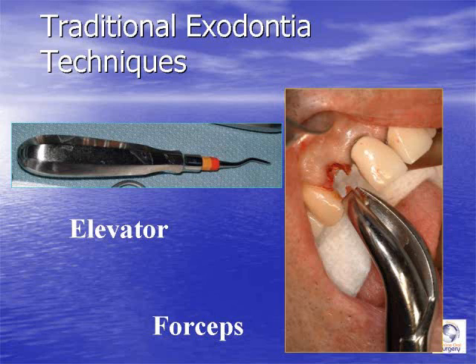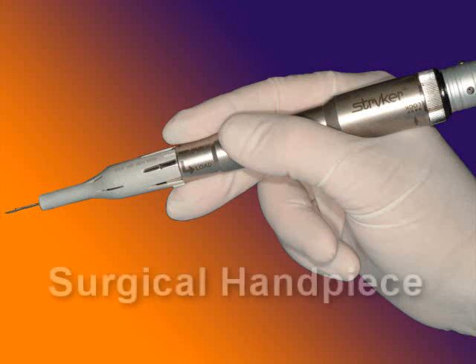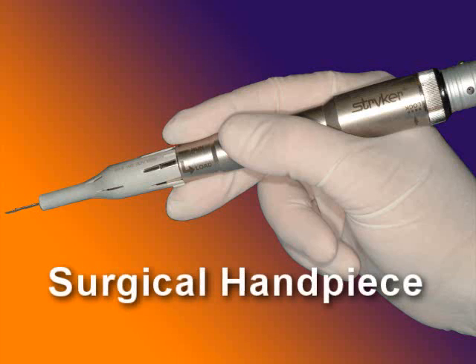In the aesthetic zone, this can cause a significant cosmetic problem. The practice of exodontia underwent a dramatic change in the 1970s with the introduction of the surgical handpiece. Prior to that, mallet and chisel were used to remove bone in order to get surgical exposure of impacted teeth and to section their roots in order to facilitate the removal. This was a slow and traumatic process for the patient and was one of the reasons that prophylactic removal of teeth, especially third molars, was rarely done. Severely decayed, ankylosed, and multi-rooted teeth were also removed using the same technique. Today, the high-speed, high-torque surgical drill is the instrument of choice for these tasks. Other than this advance, the instruments and techniques used in the removal of teeth have remained essentially unchanged for the last century.